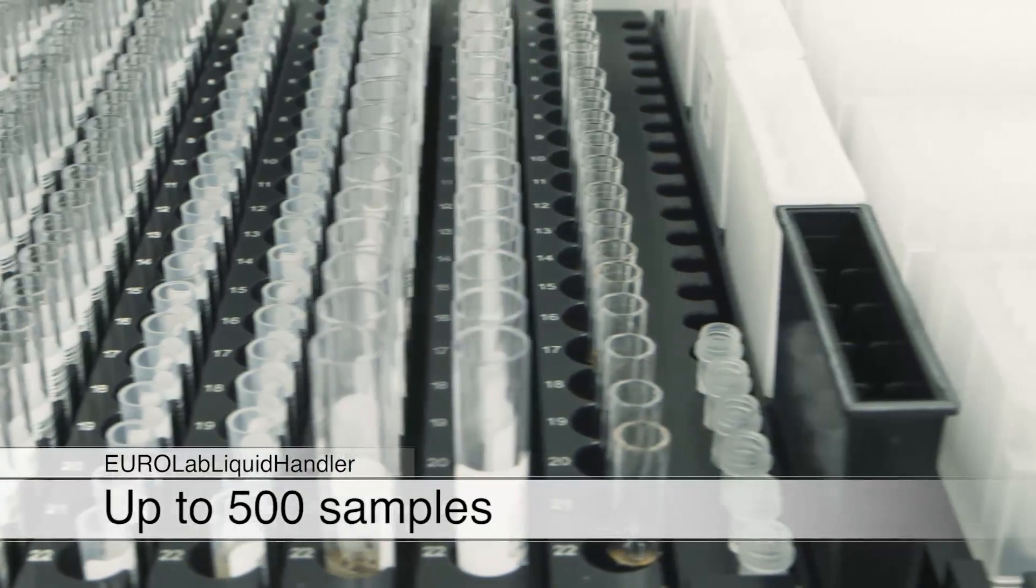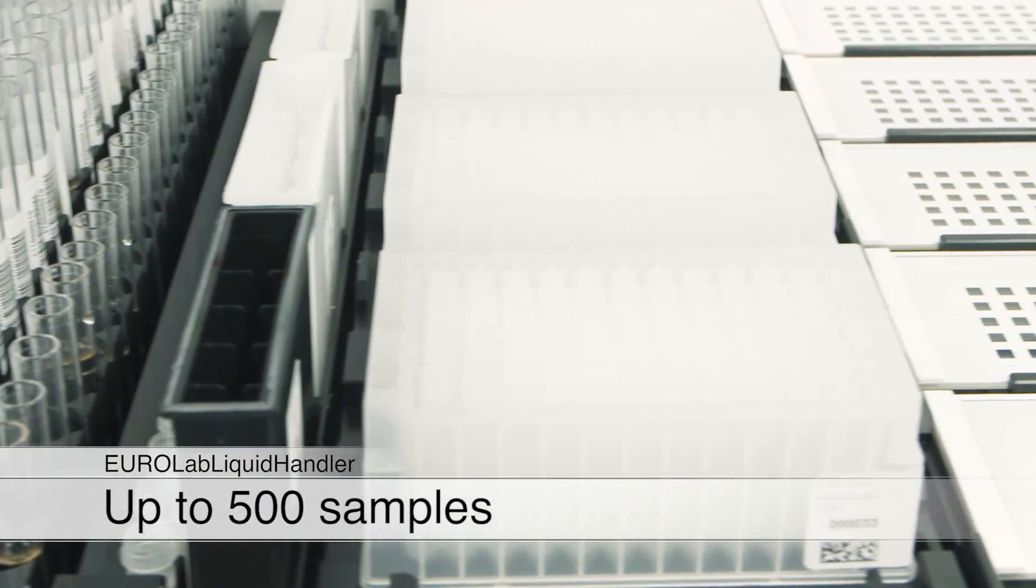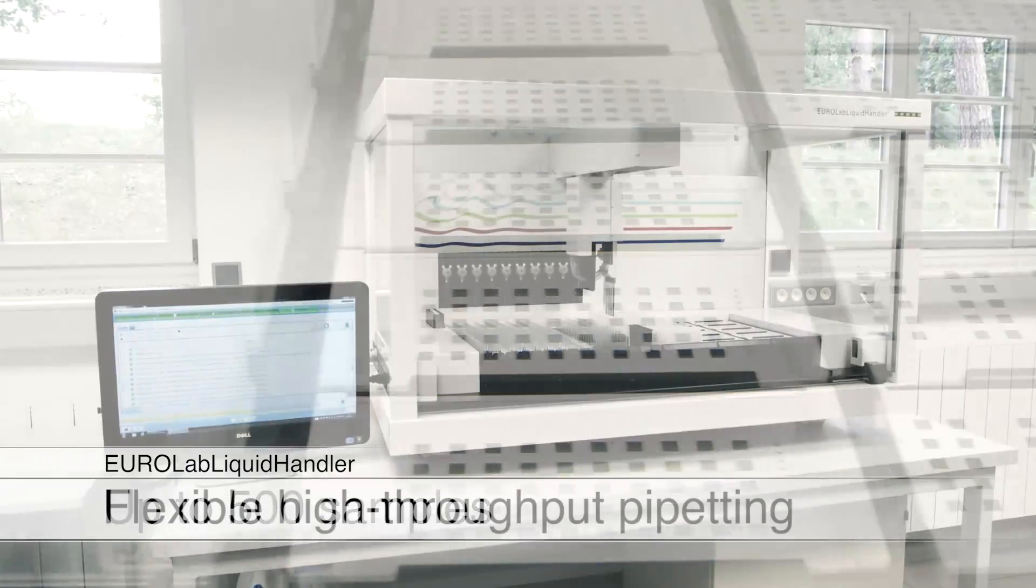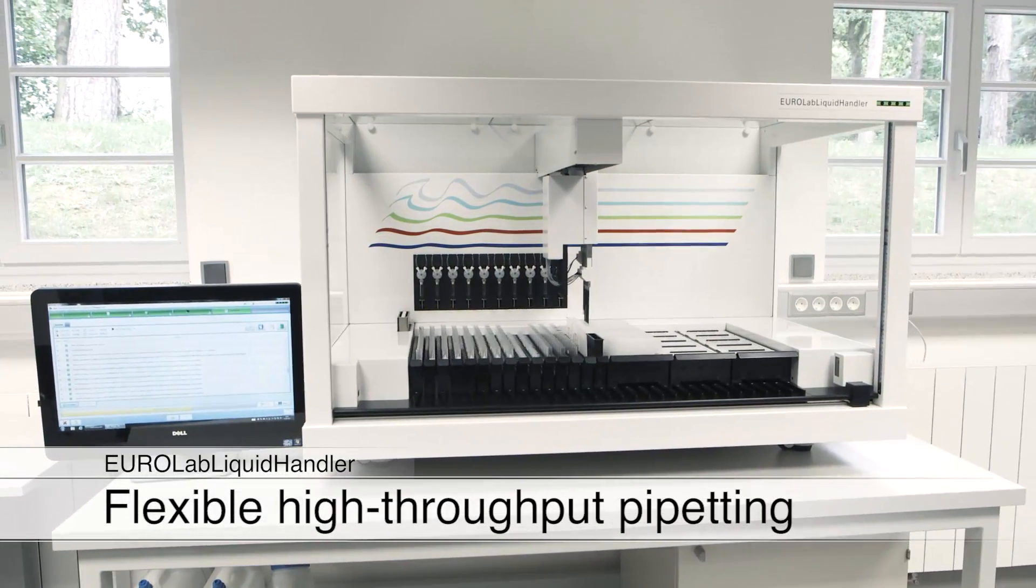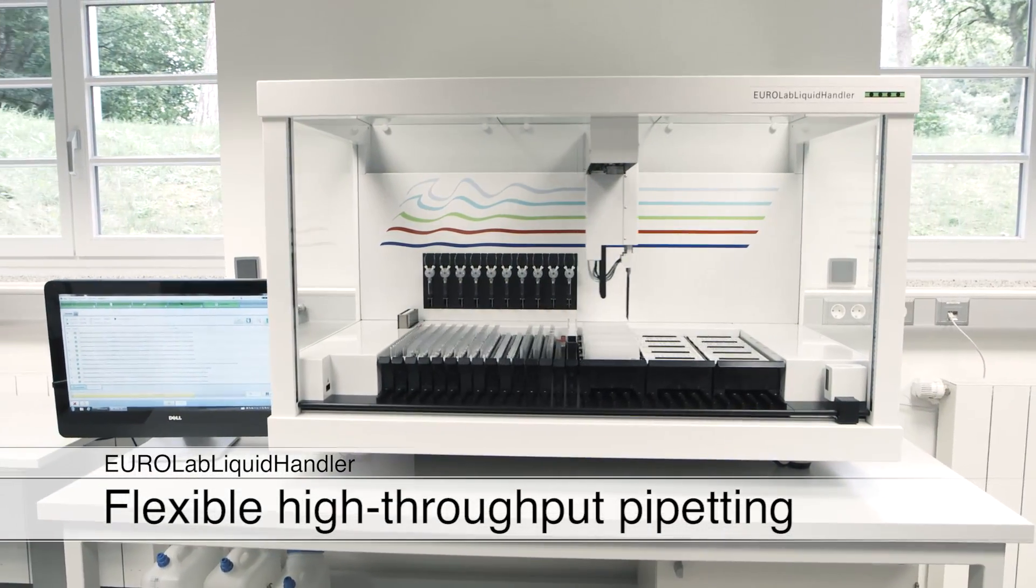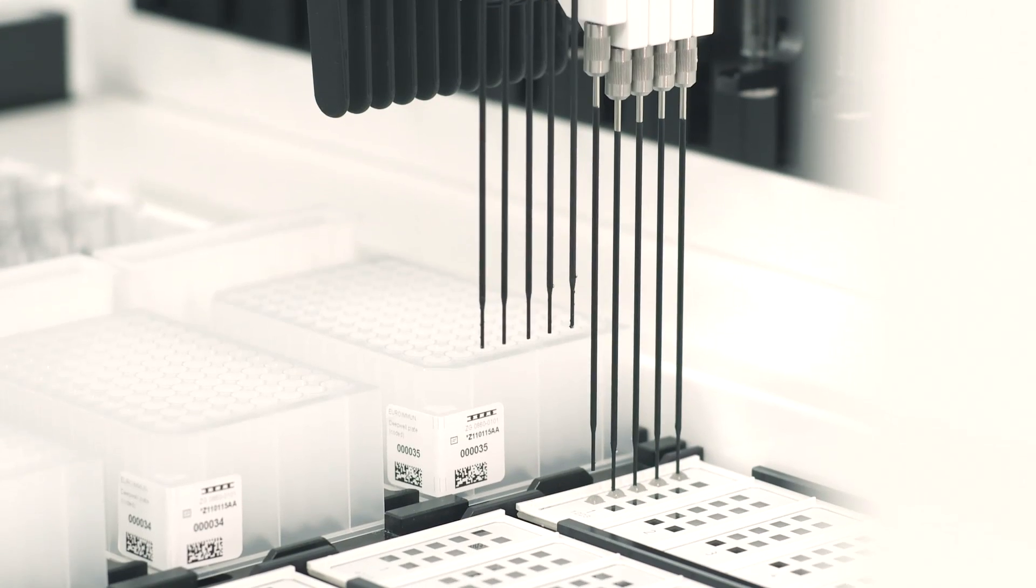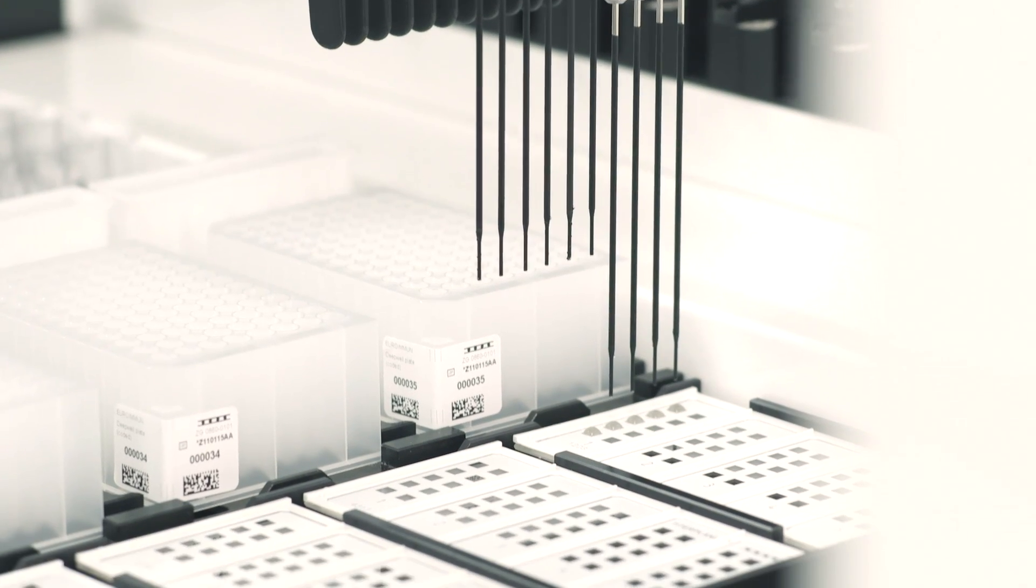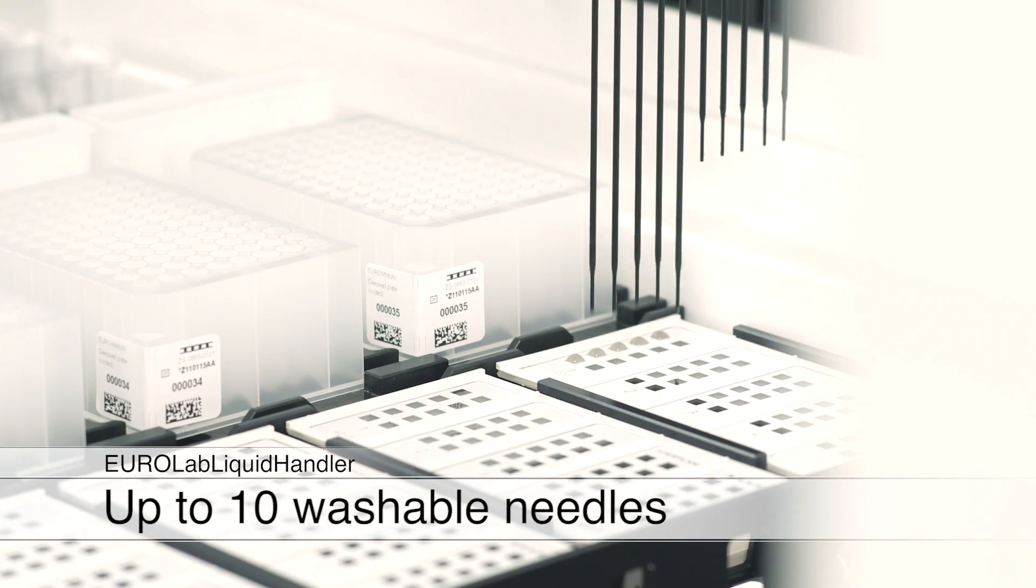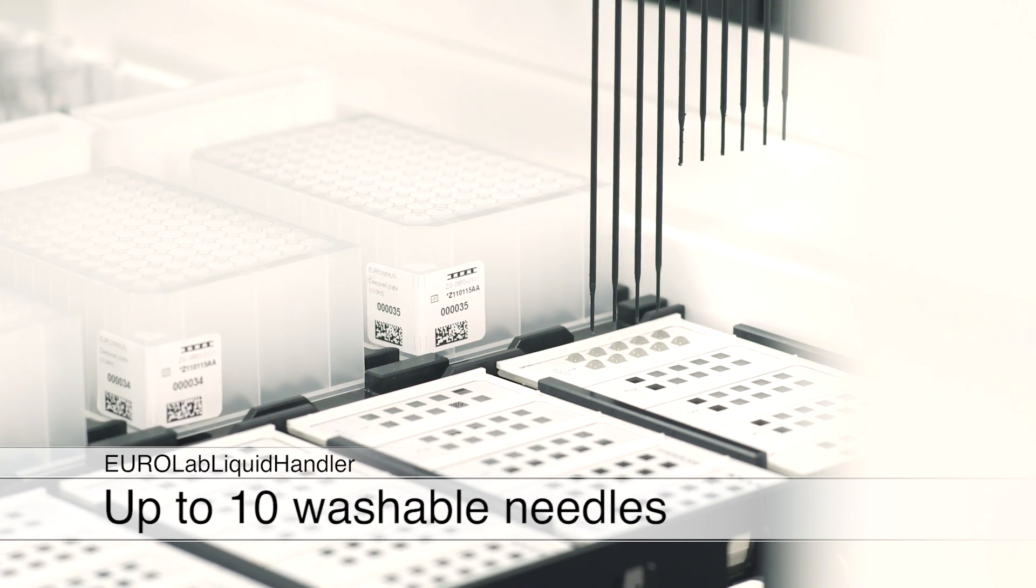A higher capacity of up to 500 samples is offered by the flexible EuroLab liquid handler. The workdeck with optionally 30 or 45 racks and up to 10 washable needles enables the highest possible throughput in immunofluorescence processing.